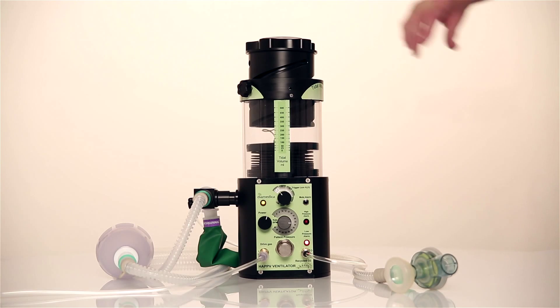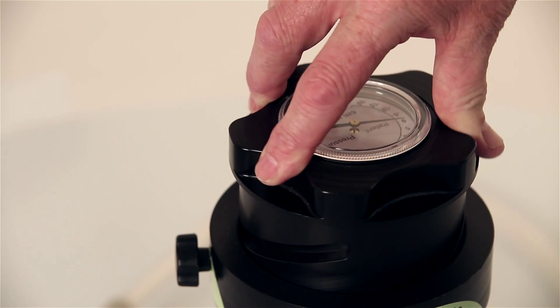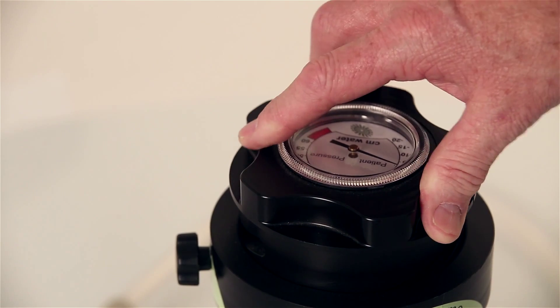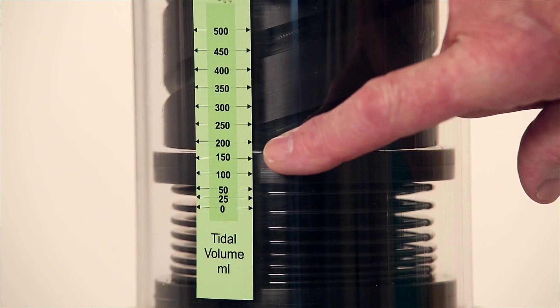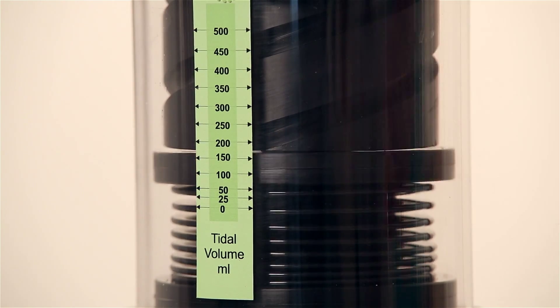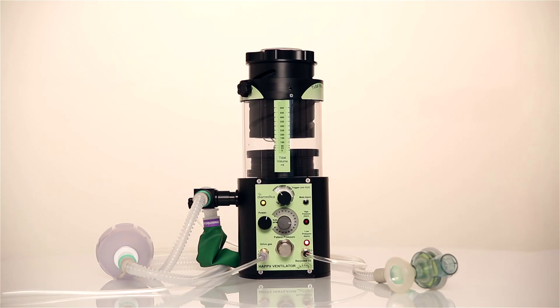The tidal volume is controlled by turning the helix screw on top of the bellows and reading the setting here. It can be used either as a volume generator or in a pressure limited mode depending on the setting of those two parameters.